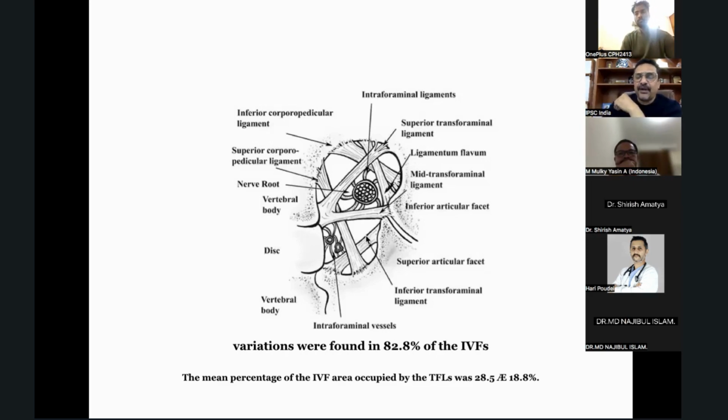I just went inside the foramen, and we could see a lot of ligaments which are basically growing crisscross, and probably they were compressing the nerve root. I just cut those ligaments, cleared some part of the disc material from there, and the patient was having absolute pain relief the moment she came out of that. Before the procedure, she was in terrible pain, and she was 83 years old. They were not willing, and she was also not fit for the surgical decompression and the surgical fixation. So this is what we can also do for these kind of patients.